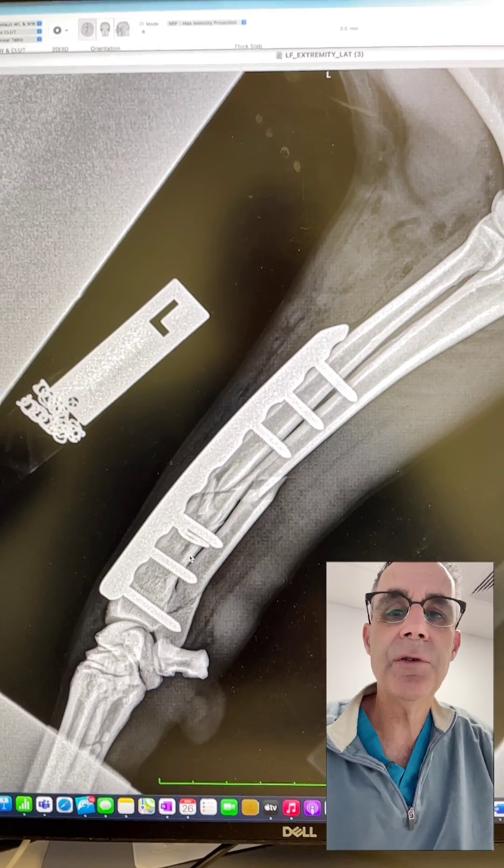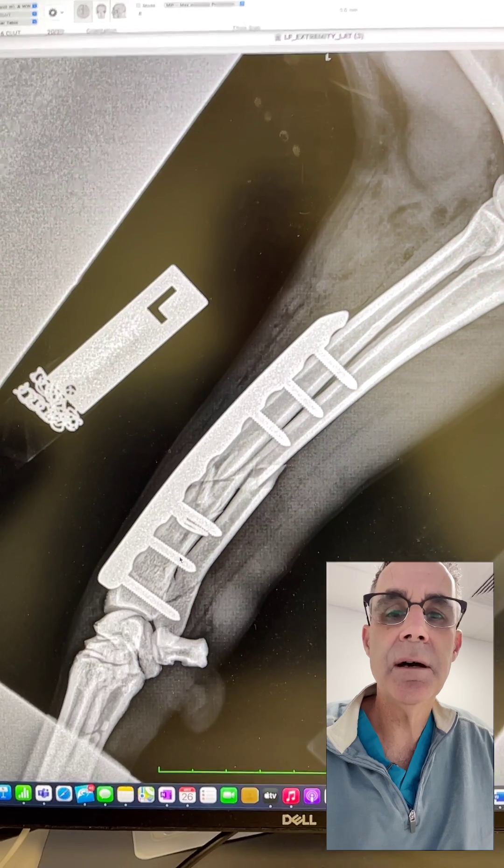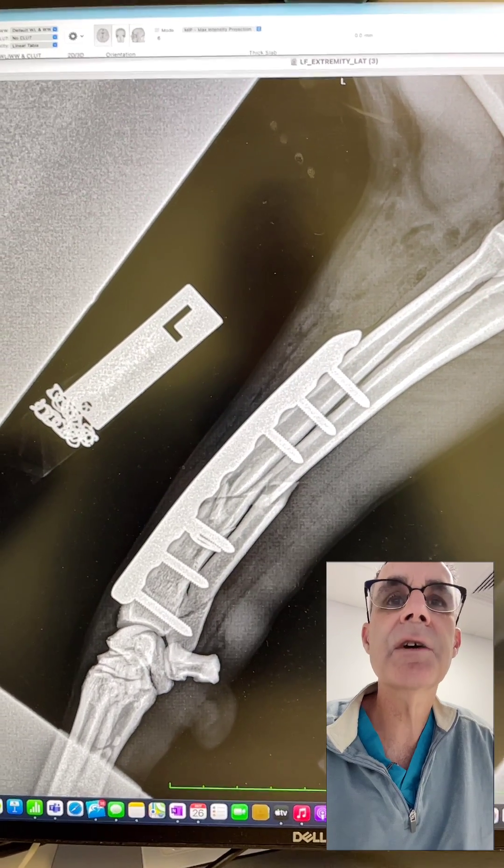Hi guys, this is Charles. I'm one of the surgeons at Southpaws. These are the post-op radiographs on the Labrador that we repaired the radius ulnar fracture yesterday.